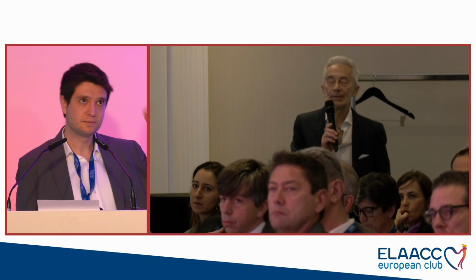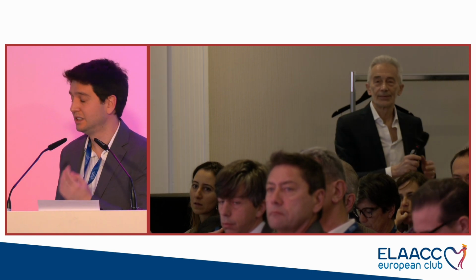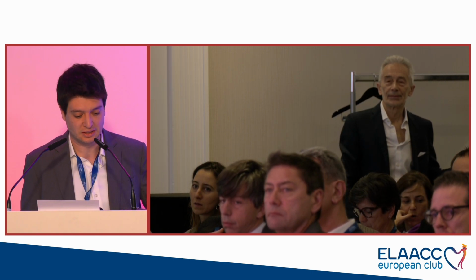I don't know, I've seen very weird cases here. The second case that I showed, with the Amulet that is developing DRT, I have some doubts. I think it can also help in all the cases, because as I said, it depends a lot on other factors, the hypercoagulability state of the patient and the anatomy of the patient. So I don't know if I could be so sure about that.